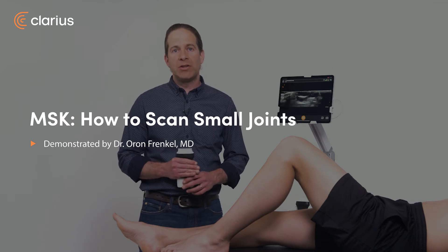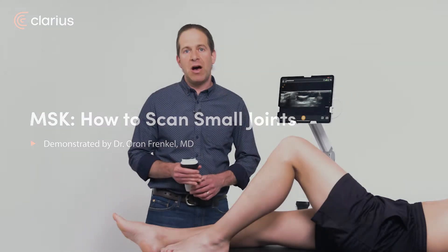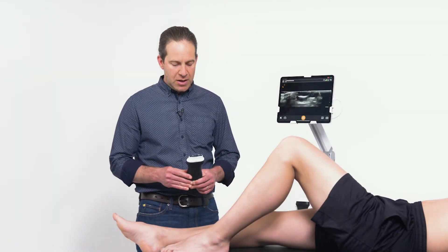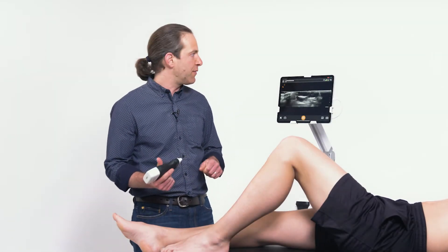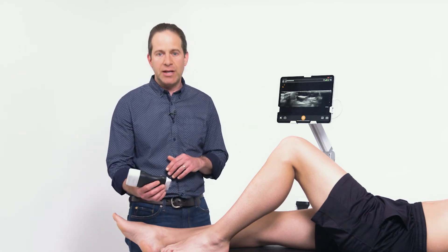For patients presenting with pain or swelling in their hands and feet, bony integrity and joint effusions can both be evaluated with a point-of-care ultrasound. I'm using a linear scanner here with a high frequency on the MSK setting, and in this example I'm examining his first metatarsal phalangeal joint.